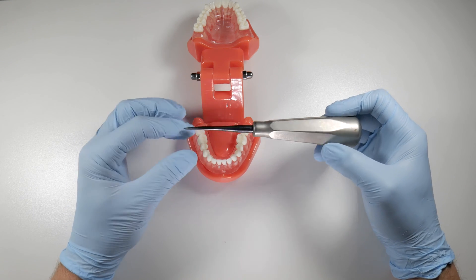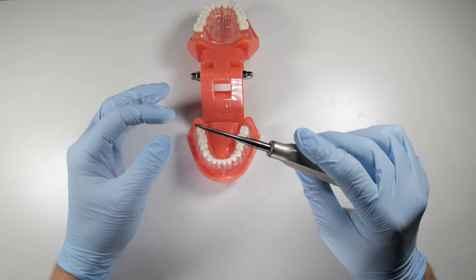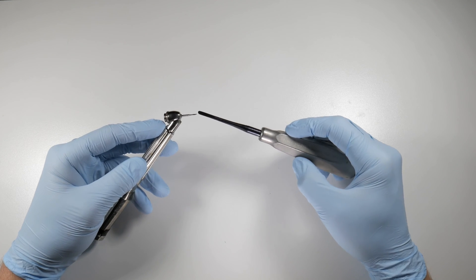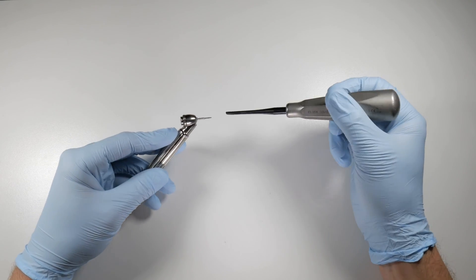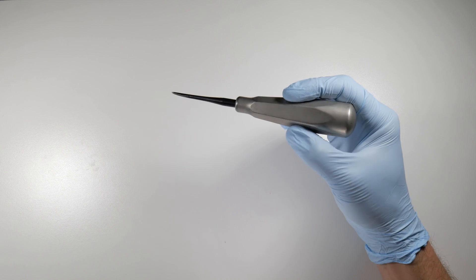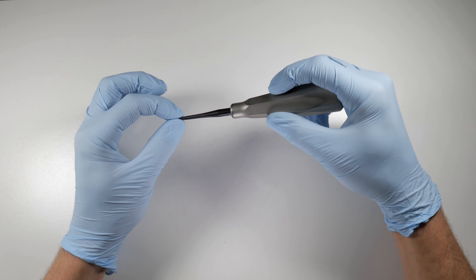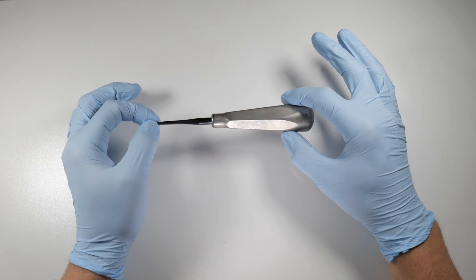Luxators come in all shapes and sizes, some with curves or bends on the end. They give you another way to attack a tooth when elevation alone isn't working. We can also use this in combination with a 700 surgical burr — very thin. A 701 works too; the 702 is getting a bit large. Using the 700 or 701, punched down to the tip of the flutes or slightly deeper along a root, allows you to slip this luxator down apically along the root surface for a perfect purchase point, fitting between the tooth and the bone to work the root tip loose.